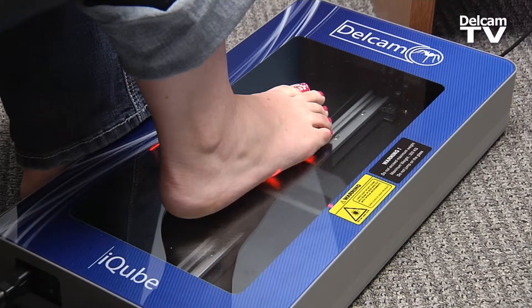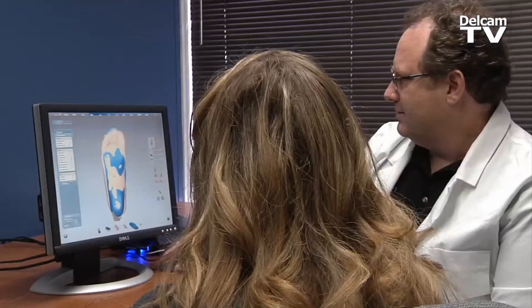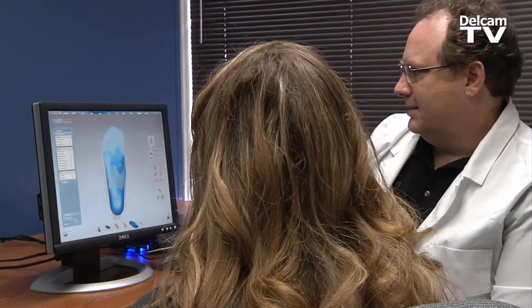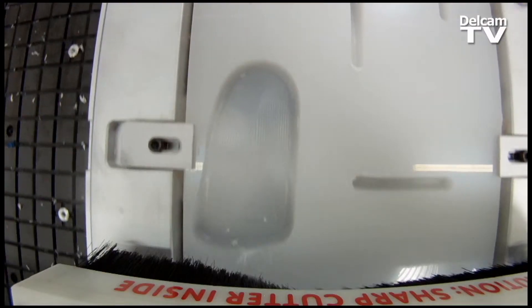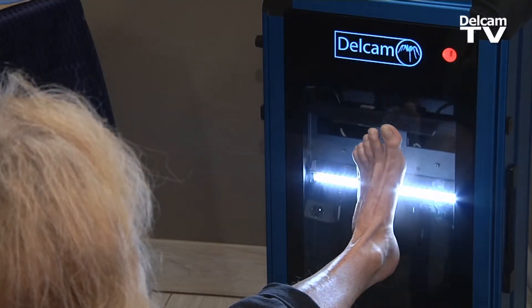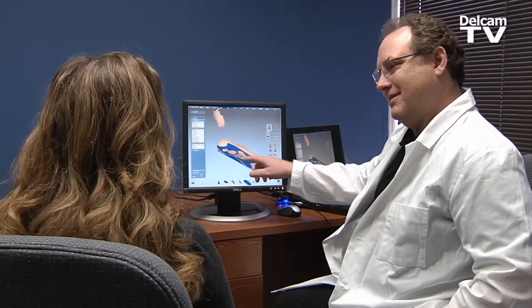So we partner with DelCam. Together with their software and hardware, a podiatrist can take a scan of your foot and make the necessary adjustments. Once that adjustment is made, the DelCam software would make the drawing of the program, the output would go to the machine, and then the machine will cut the 3D surface required to make the adjustment. And DelCam is just a premier software and hardware for doing the scanning, and they integrate perfectly with the Freedom Machine Tool and the Fagar controller, so it was a perfect match.